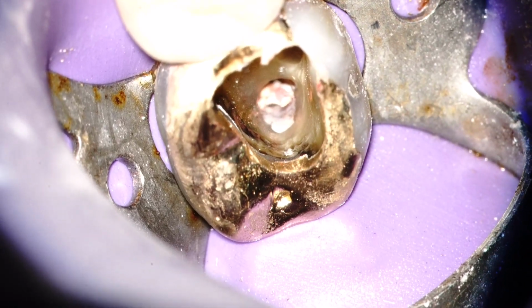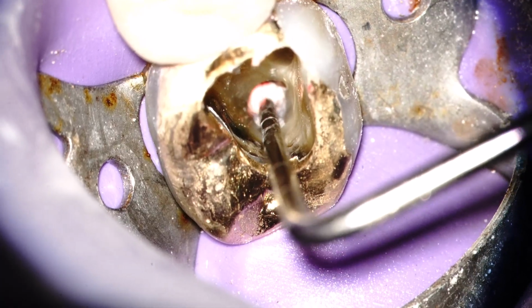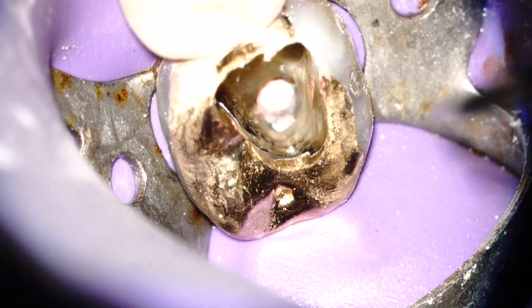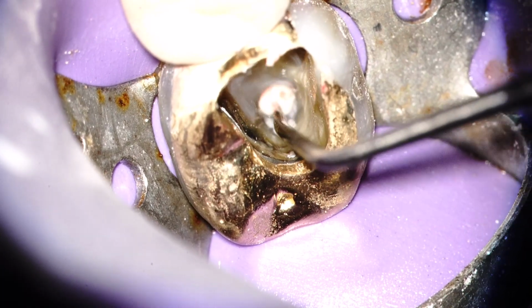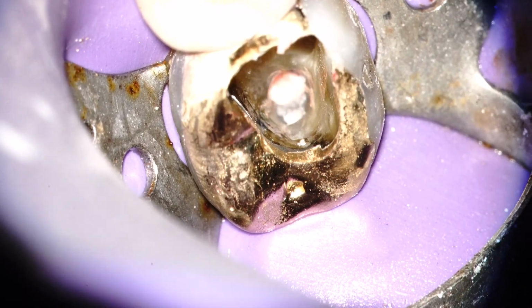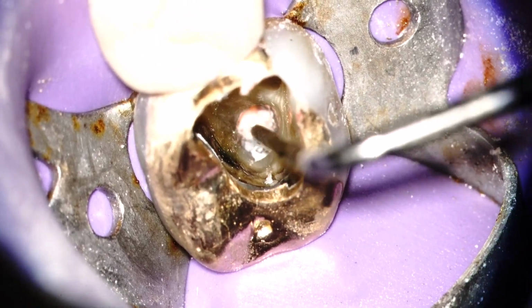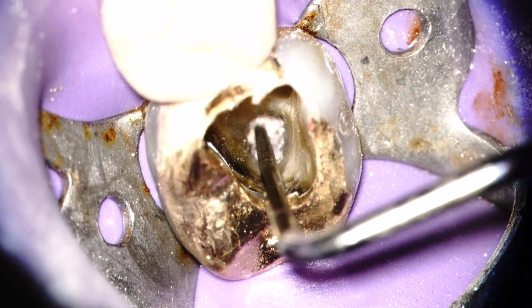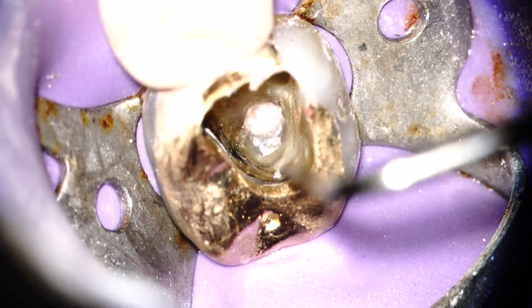Touch and heat, sear it off, lightly compress with the shoulder 10 plugger, clearing the gutta-percha off the walls, pressing, seeing excess sealer escape coronally around the cone. The touch and heat for 3 seconds. Now applying the number 9 plugger, again moving the excess gutta-percha off the walls, compacting the pad, applying pressure, allowing the gutta-percha to escape along the sides. Using the touch and heat, applying 3 seconds, removing excess gutta-percha.